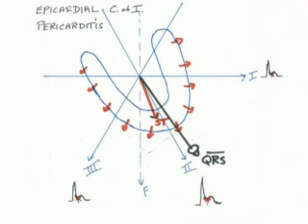Pericarditis creates an epicardial injury current, but one that is referred to as diffuse. Now the easiest way to see diffuse is to say, well, geez, every lead on the EKG except AVR has ST segment elevation. That's sometimes the case. What I find more useful is to look at 1, 2, and 3 in the frontal plane. If you have ST segment elevation in 1, 2, and 3, no myocardial infarction can give you the same vector. So that is the diffuse vector of pericarditis.